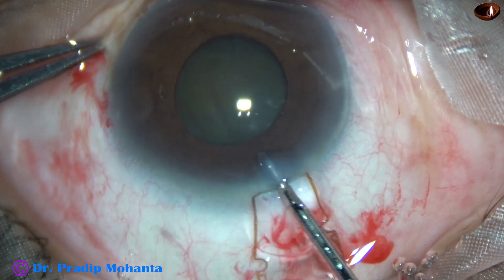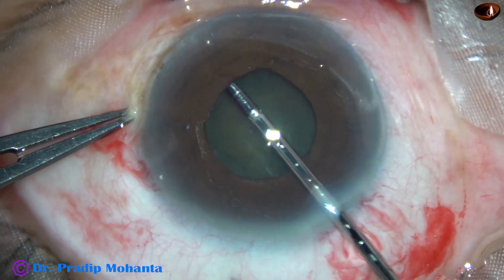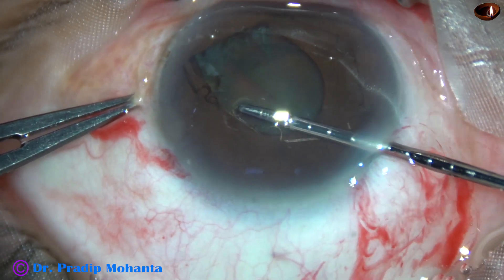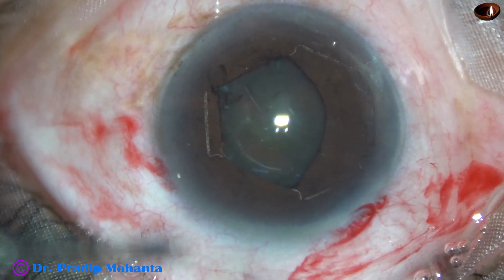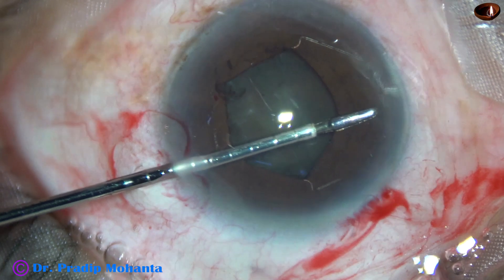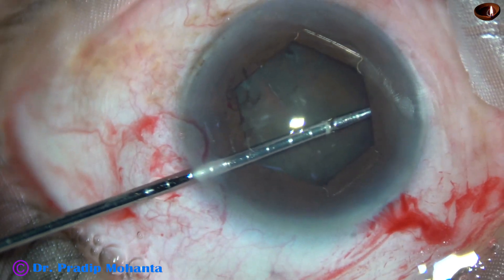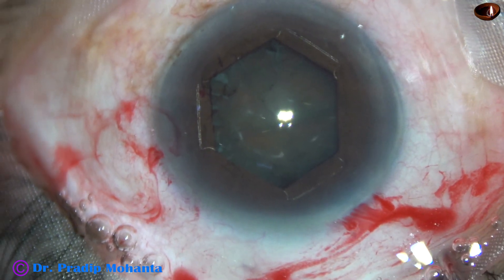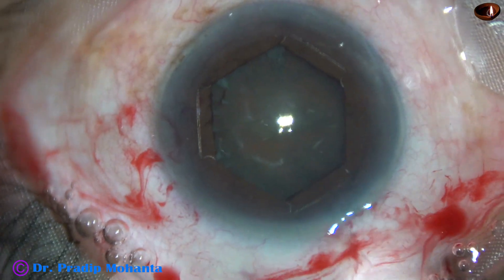This is the device — it has got flanges and notches. Alternate flanges are tucked under the iris. This is a uni-planar device. Since I have only one side port, I am using the main wound to tuck the flange at 1 o'clock. I go through the left side port and tuck the flange at 10 o'clock. Now, alternate flanges are tucked: 10 o'clock, 1 o'clock, and 5 o'clock — these three flanges are tucked. The other three flanges are over the iris.